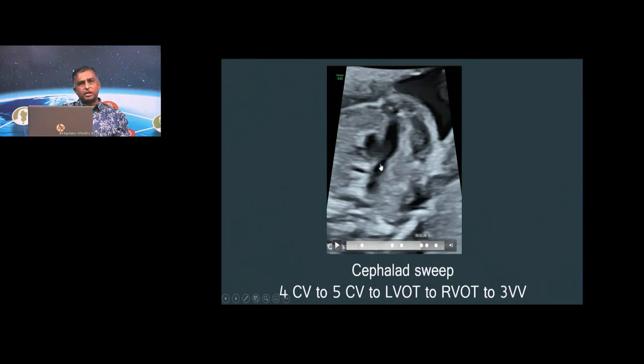You have in long section, you have the short section of the aorta, and you have the SVC here. That's the trachea, which is actually dividing into the carina over here. It's actually bifurcating into the 2 bronchi there. So this is a 3-vessel view.